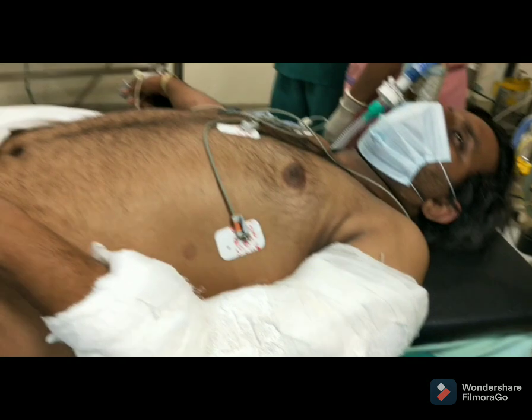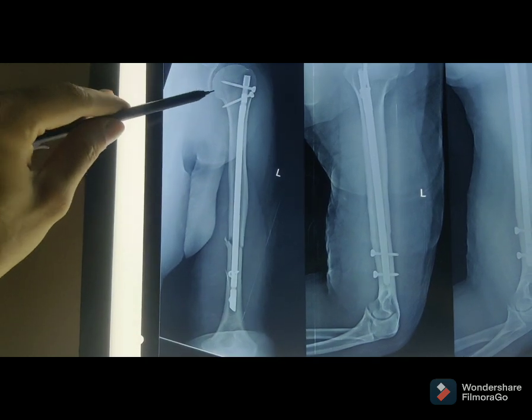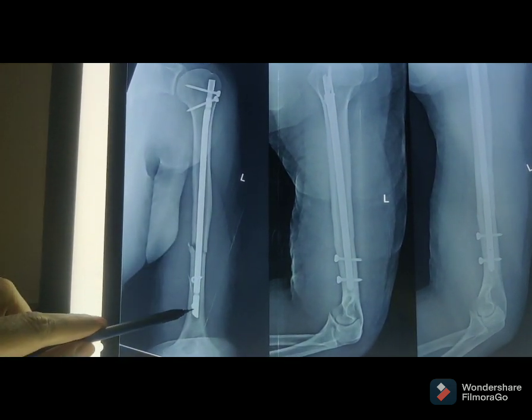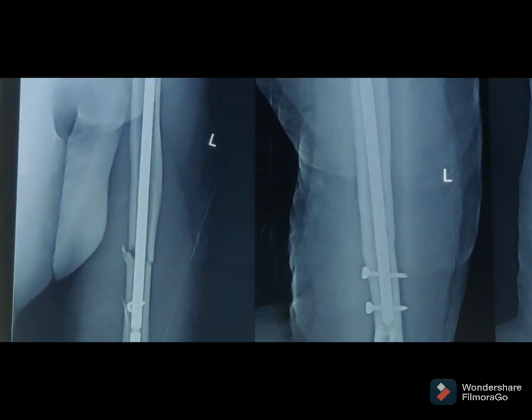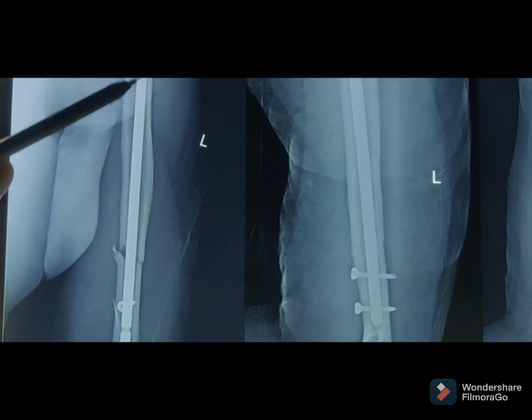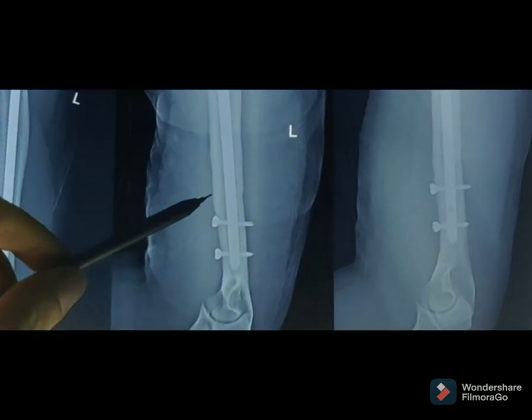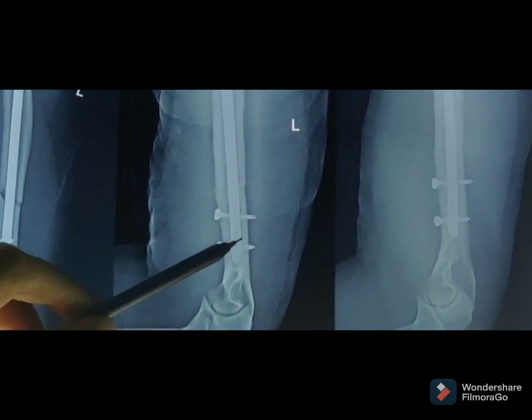So we are planning for interlock nailing. This is the surgery — we put in a rod, which is called intramedullary nailing. In the center of the bone, the rod is placed. The area helps to guide the placement. Two screws are not visible in the lateral view, and two screws are not shown in the AP view but you can see them in the lateral view.